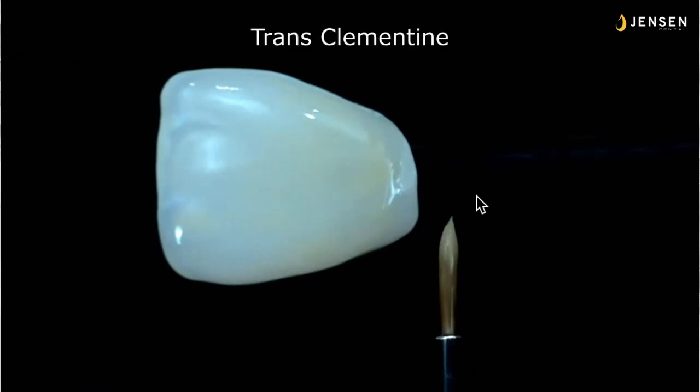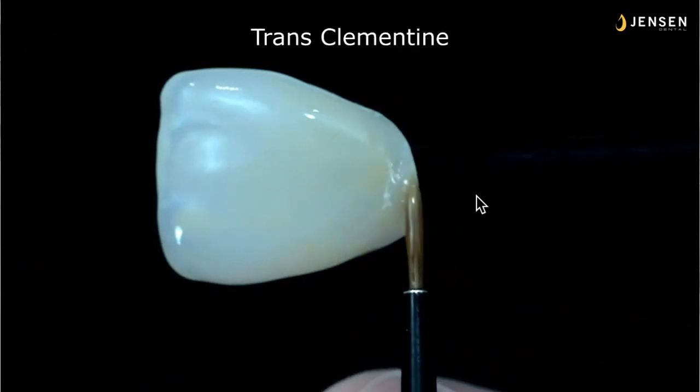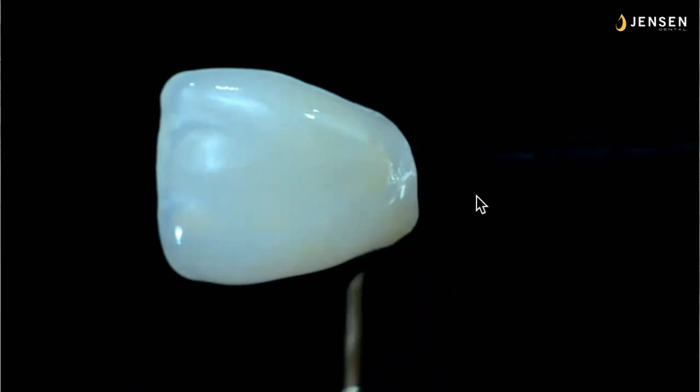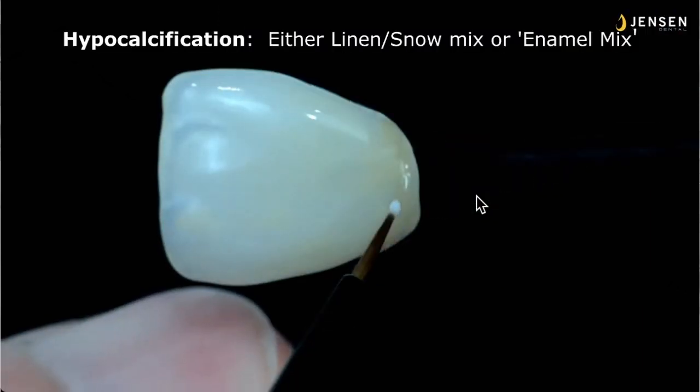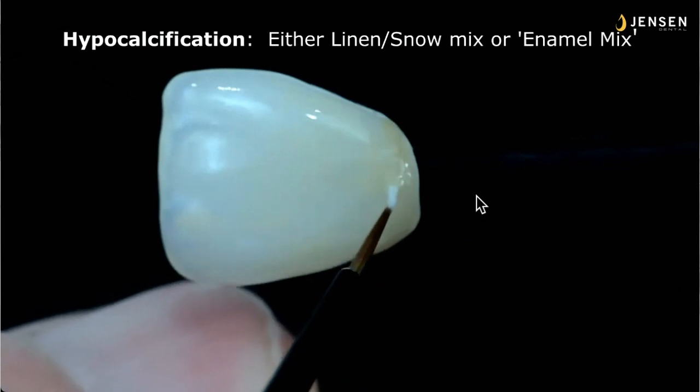This is a zirconia restoration. So this is the Clementine. Clementine's great for fissures, to give like a dentin type effect. It's good for root sections. It's kind of a tangerine, kind of a translucent tangerine color with just the slightest hint of a walnut brown in it. So it's really good for central fossa areas and posteriors. It's good for root sections because it's translucent.